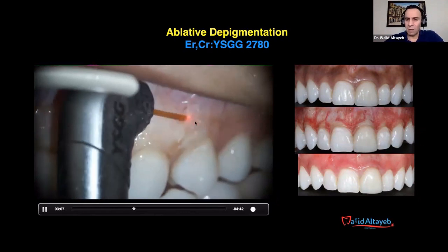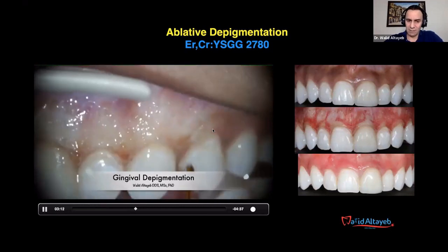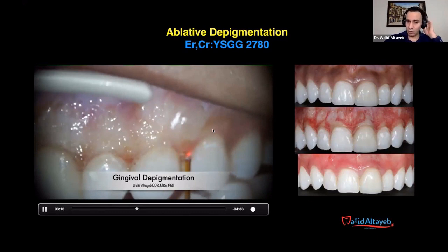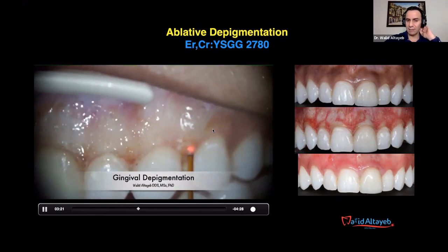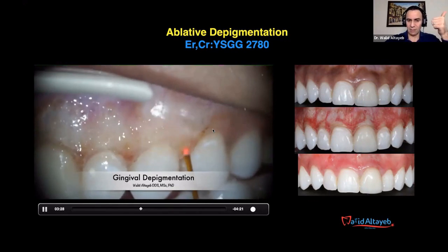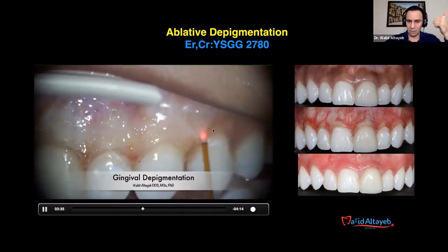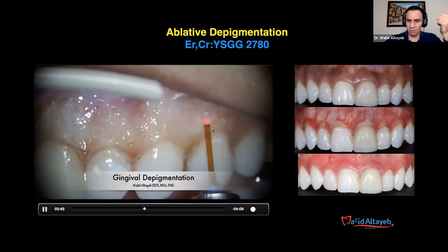And this is the only the amount. And this procedure is completely done without any kind of anesthesia, no topical, no infiltration. But again, as an example, when you transfer it to a small 700 micron, the patient will feel pain. So if the patient feels pain, that's your strategy: first, short pulse duration. Second, less frequency, less hertz. If the patient feels pain at 50 hertz, make it 30 hertz. The energy, you don't need to exceed more than 45 millijoule.